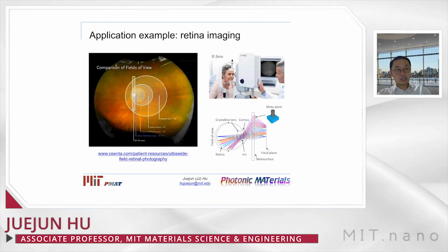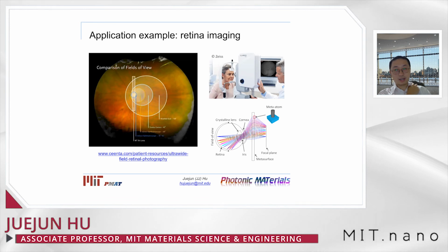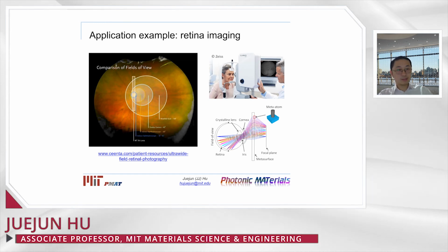Besides endoscopic imaging, our second example here is for retina imaging or fundus photography. The photo on the right side shows an example of a benchtop fundus camera system that is used to capture images of the retina from a patient. Conventional fundus cameras have a fairly limited field of view that does not allow capturing the entire retina in one single image. Later on, people developed so-called wide field imaging systems with a field of view exceeding 50 degrees. More recently, state-of-the-art retina imaging systems can even offer a field of view exceeding 180 degrees using so-called ultra-wide field technology. Now, these wide field imaging methods are all built on the confocal laser scanning technique, which is not only complicated and has a large footprint, but also comes with a significant price tag.